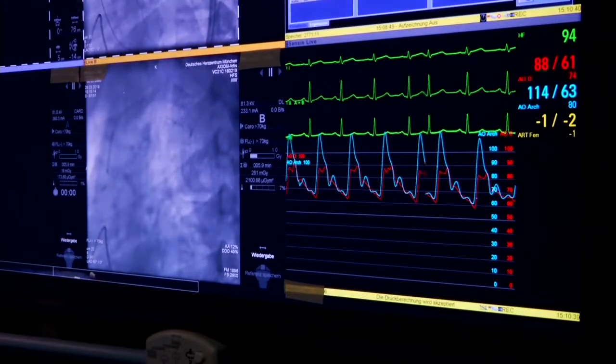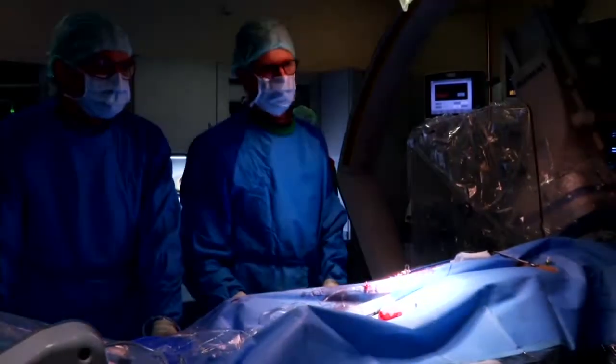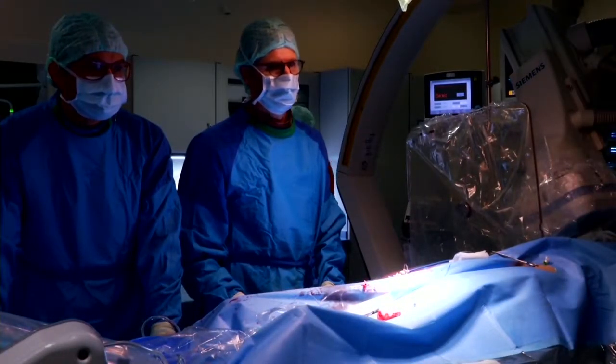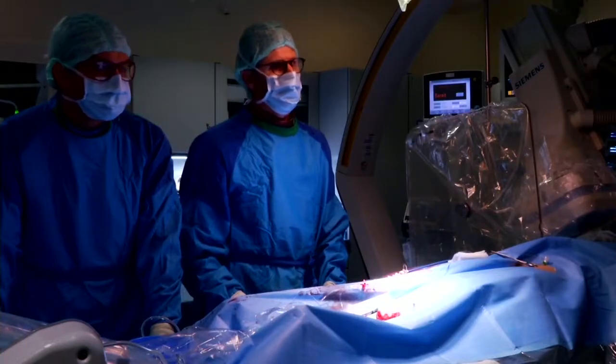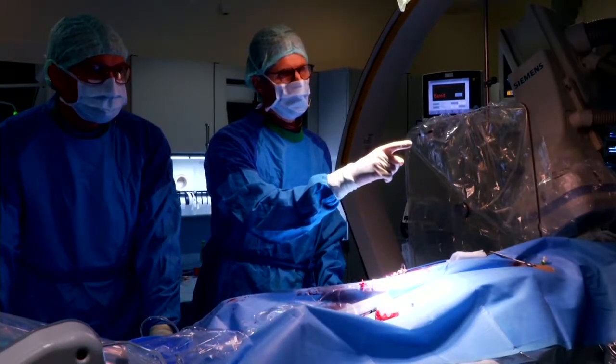It's only in the inferior wall, right? It was flared. So ballooning, since the top part is not stented, probably won't make a difference, I suspect. Okay. So you may have to put your stent a little more distal, so we can get rid of that gradient.